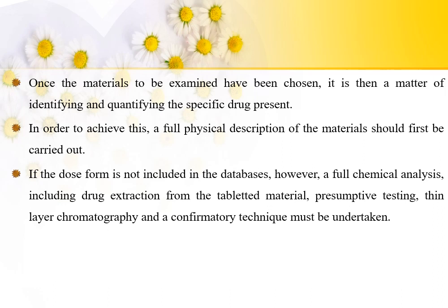Once the material to be examined has been chosen, it is then a matter of identifying and quantifying the specific drug present. In order to achieve this, a full physical description of the material should first be carried out. If the dose form is not included in the database, a full chemical analysis including drug extraction from the tableted material, presumptive testing, thin layer chromatography, and a confirmatory technique must be undertaken.